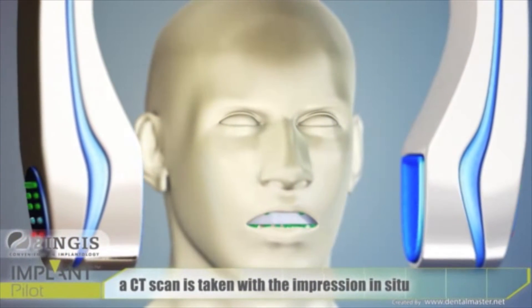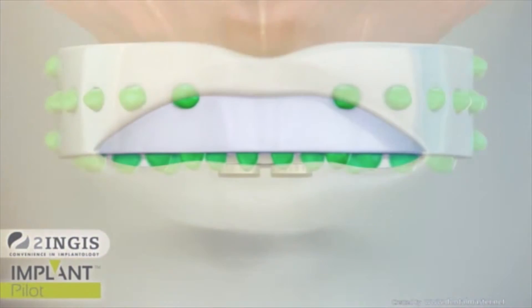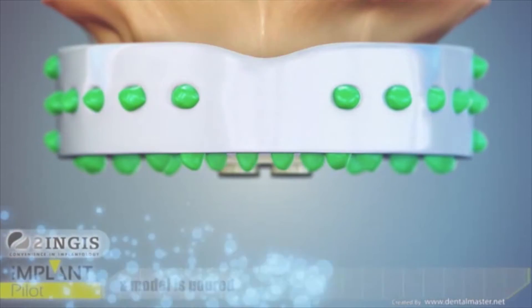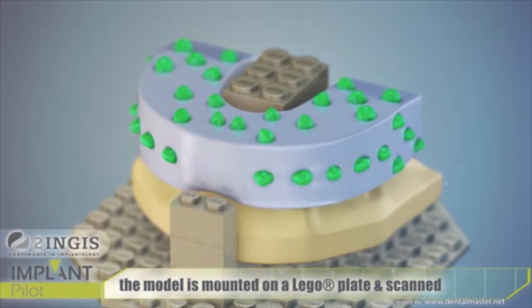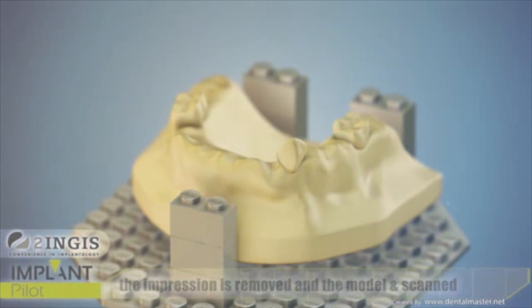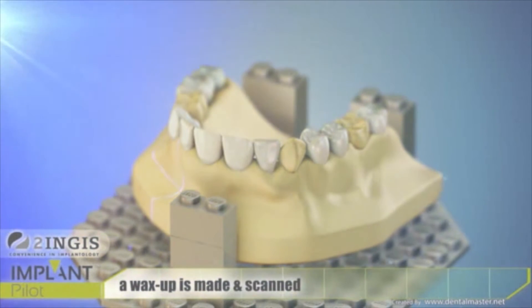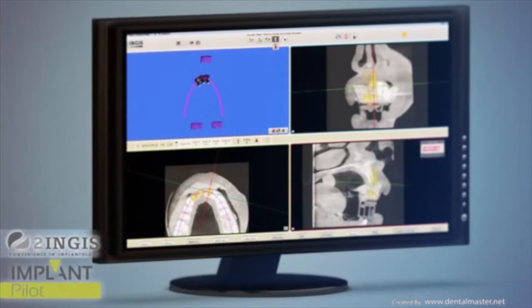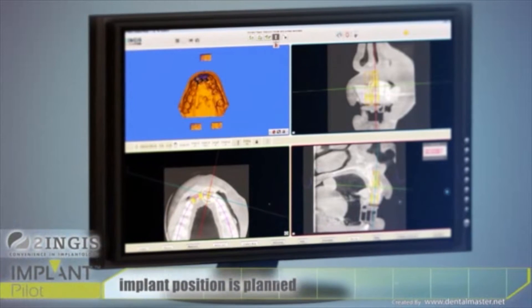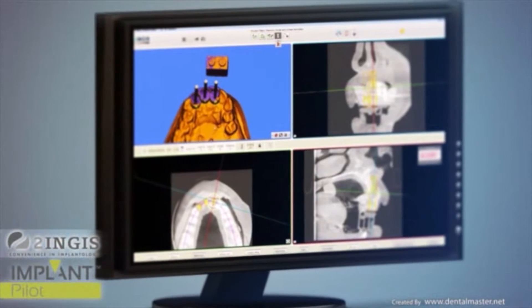First we need an X-ray of the patient in the correct position to control the X-ray information. We make an impression from the patient, and on the impression we put a Lego brick — the Lego brick is a reference and it is radiopaque. So when the dentist does an impression with a Lego brick, you can place it in the mouth, do the CBCT, and then check in the CBCT if the patient made a movement or not.